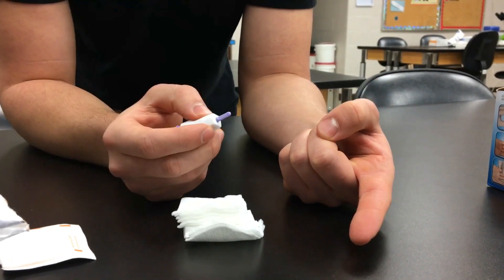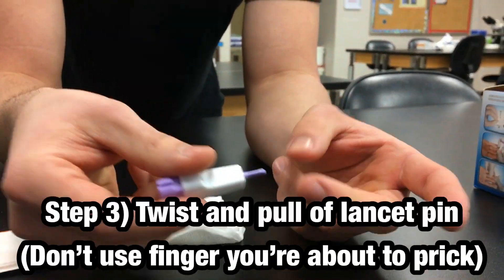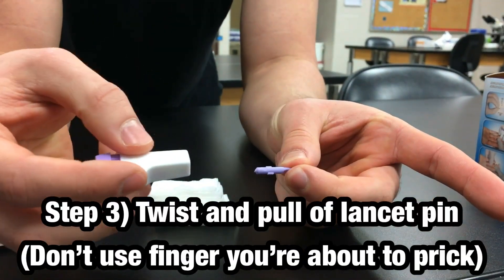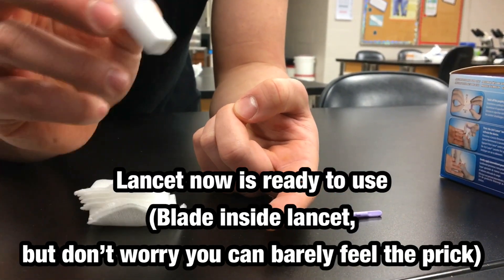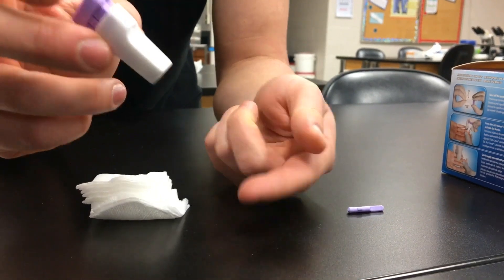Once your finger is fully dry, you're going to go ahead and take the lancet. You want to twist and pull off. Now the lancet's already ready to use, so all you have to do is press under the skin, push the purple button, and it'll fire.